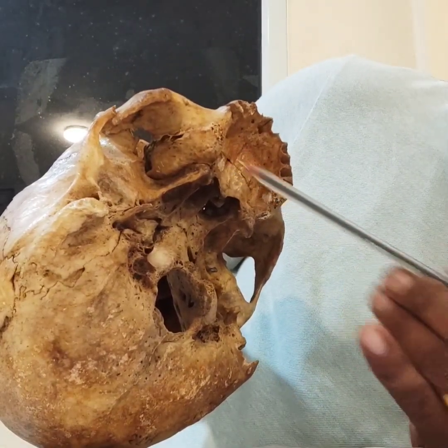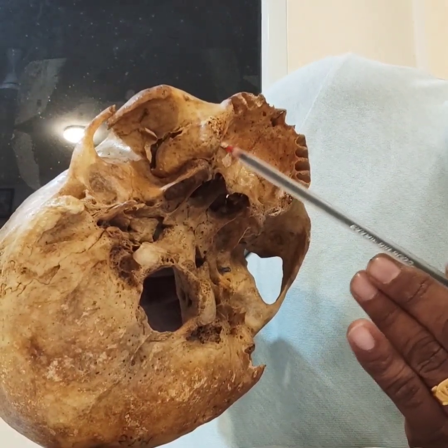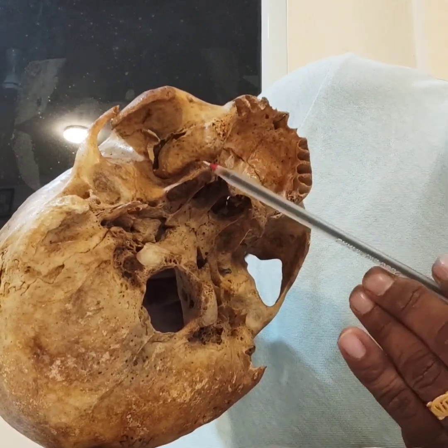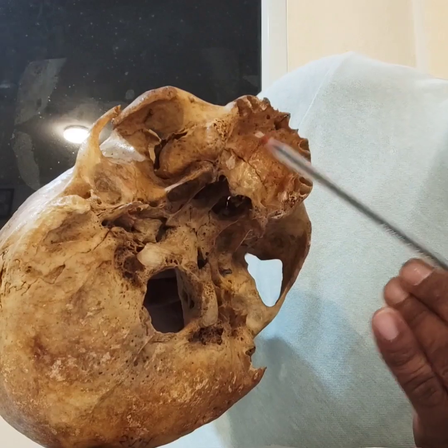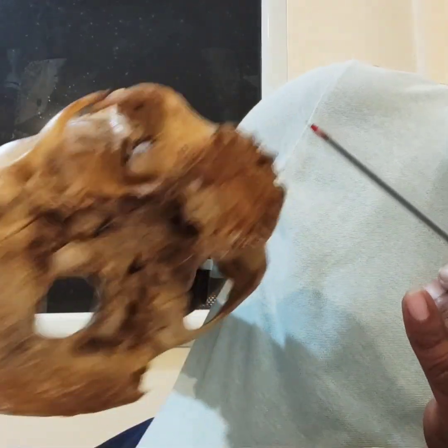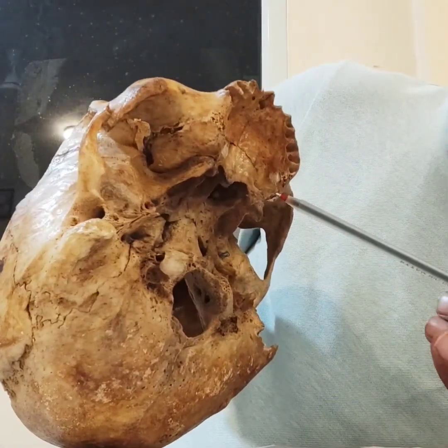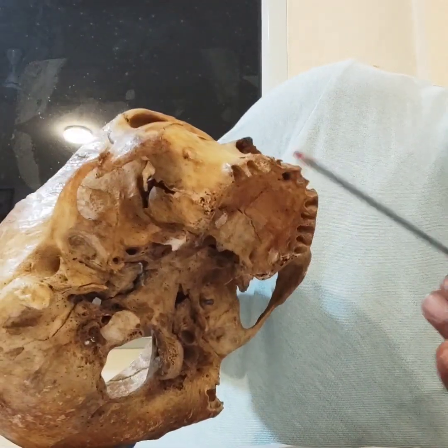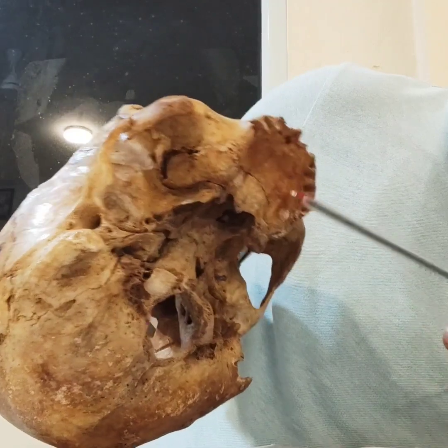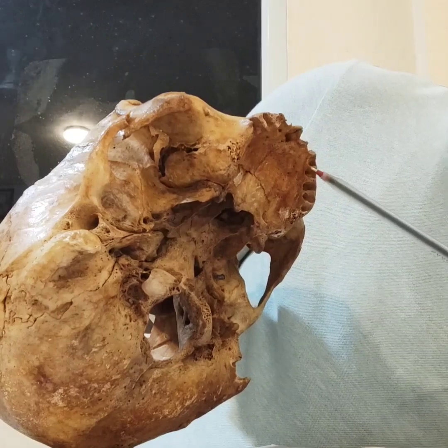We place the implant in the pterygoid area because in full mouth cases, if you can engage the implants in the pterygoid plates, you get maximum stability for the whole framework. So there won't be any cantilever effect, and your prosthesis will have good retention and stability also. So in the full mouth cases, we can do the anterior nasal sparing engagement as well as the posterior pterygoid engagement, and also the canine bypass. Usually from canine to canine we place 6 implants, and in both the pterygoids we place double implants. So totally 10 implants we place in the maxilla in full mouth cases.